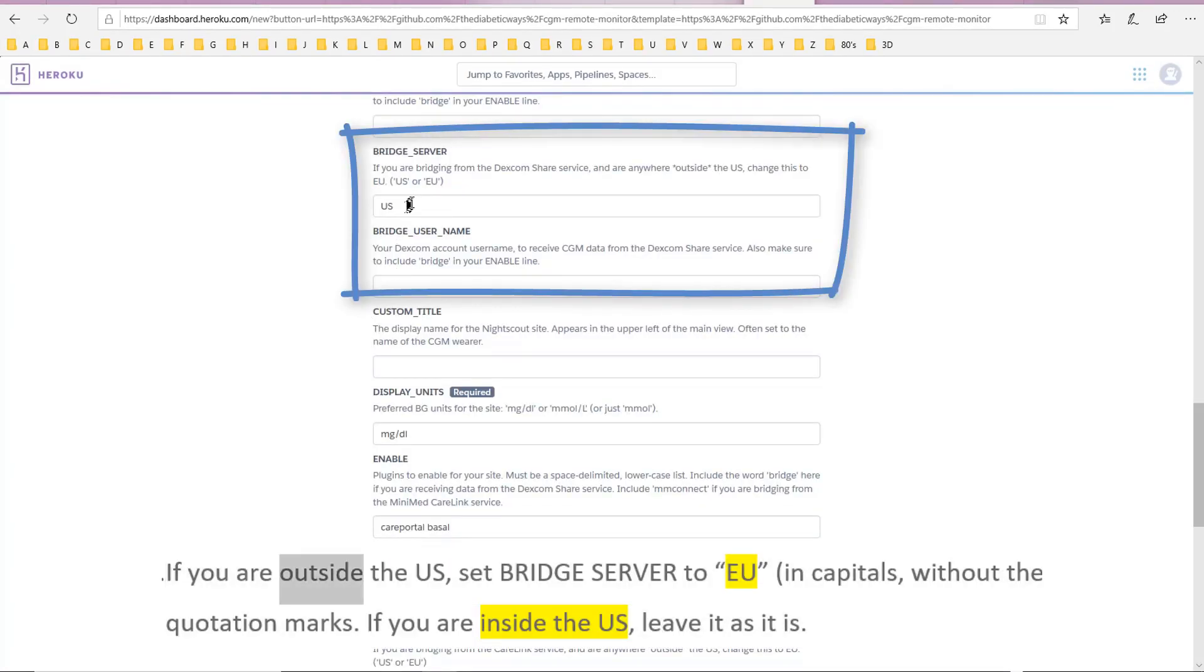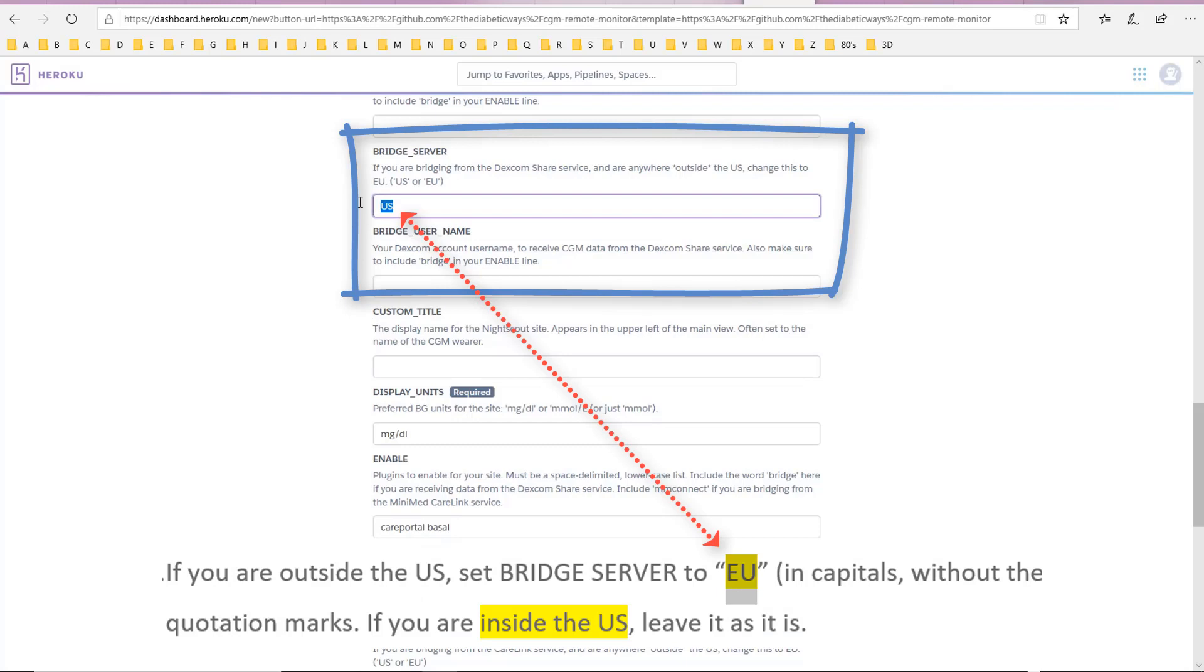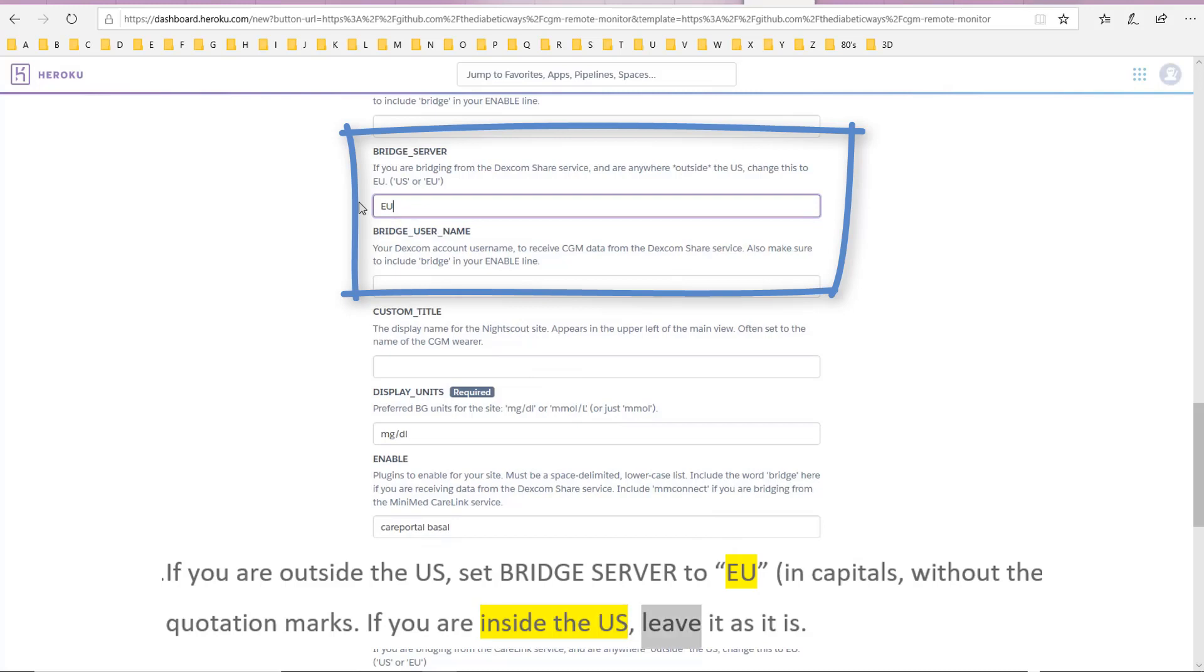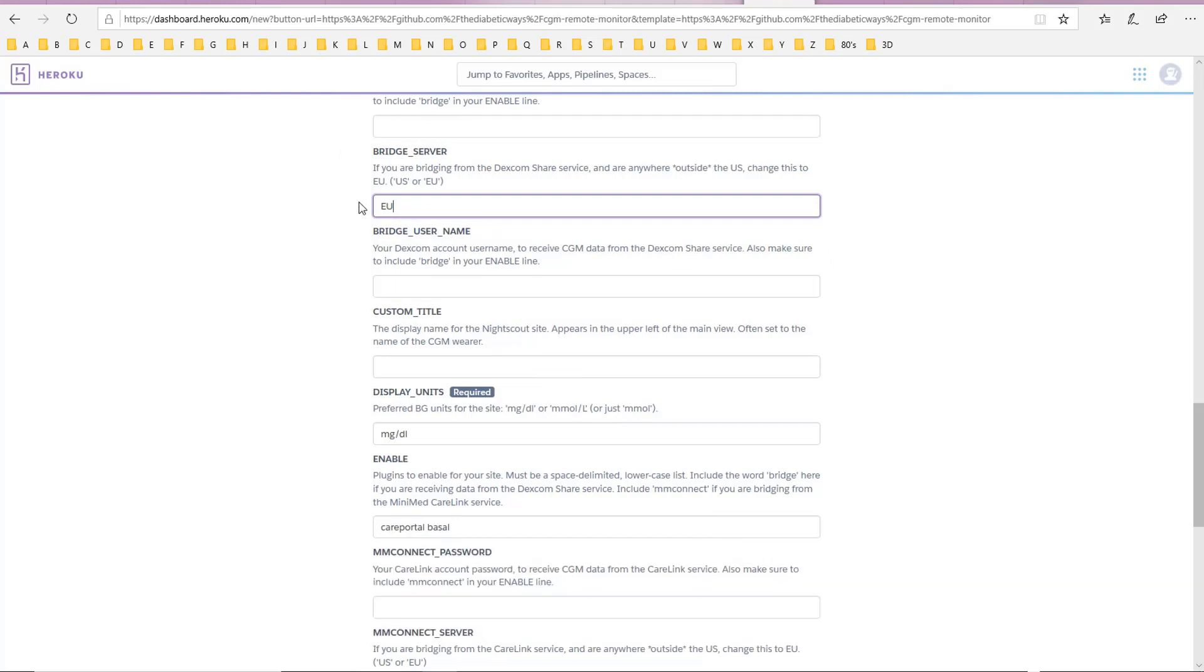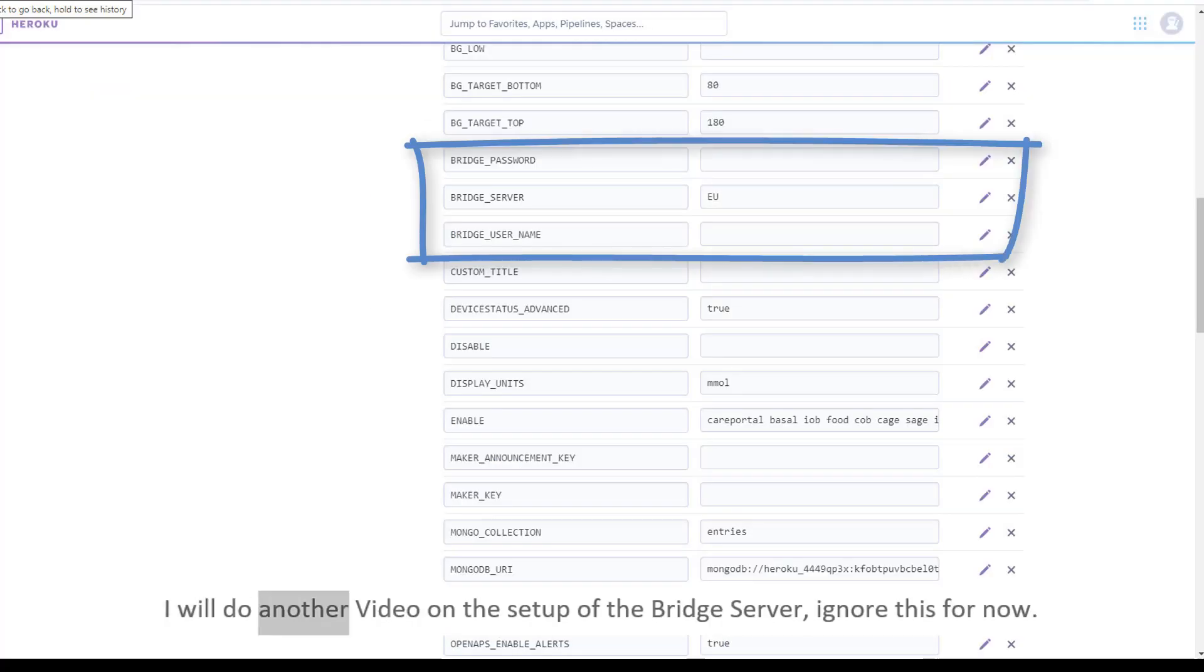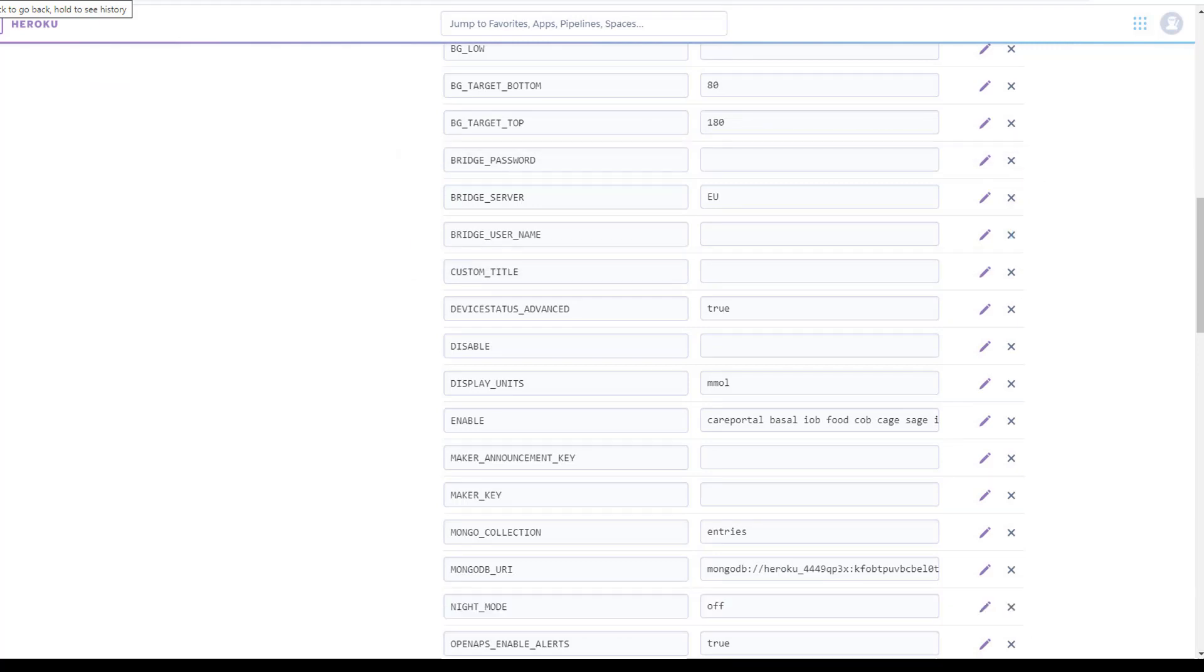If you are outside the US, set Bridge server to EU in capitals, without the quotation marks. If you are inside the US, leave it as it is. I will do another video on the setup of the Bridge server, ignore this for now.